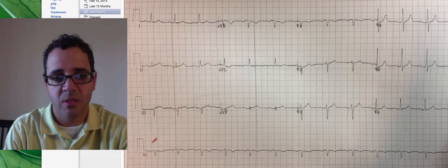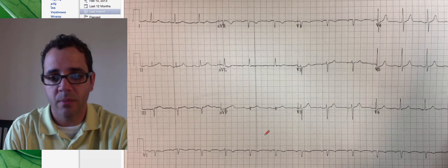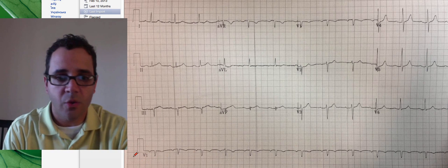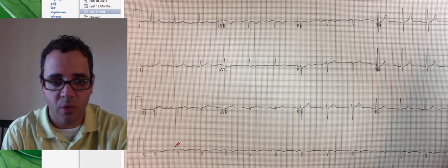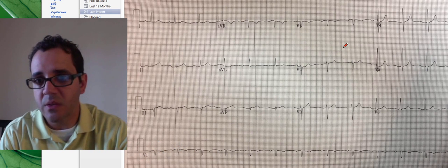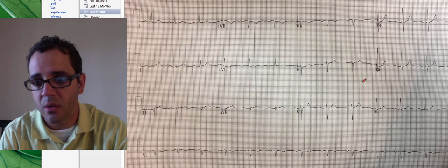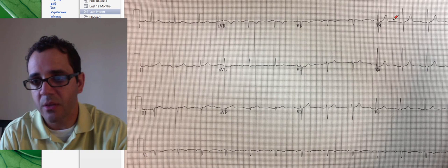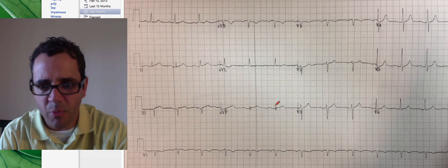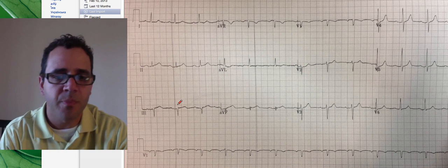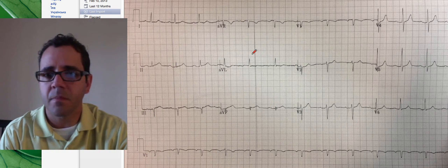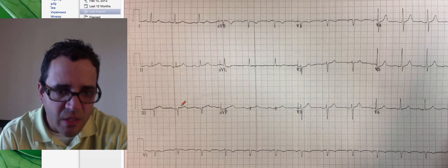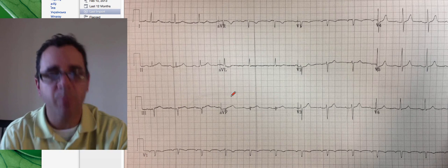The first EKG was really not diagnostic. You have positive deflection here, so you have a near normal axis, you have a pretty regular rhythm, you have every P conducted, your QRS, the ST segments look pretty good, they're not elevated, there's no depressions. Maybe a little bit of PR prolongation, that space here looks a little bit prolonged, but really a non-diagnostic EKG.